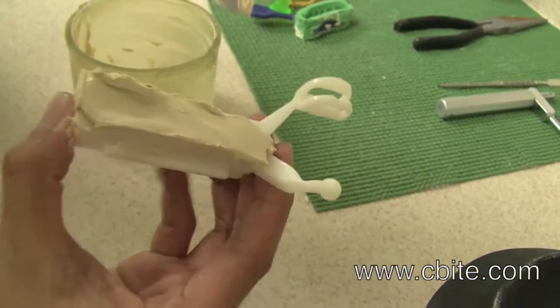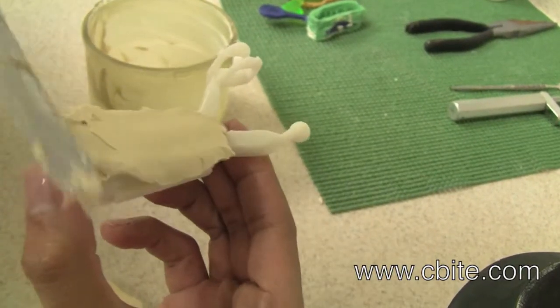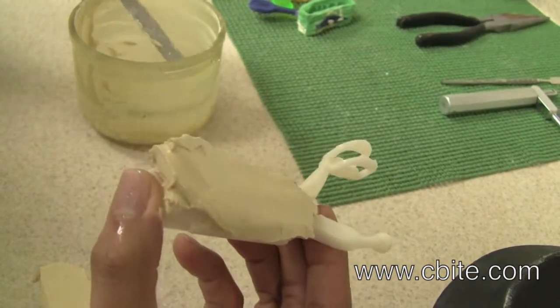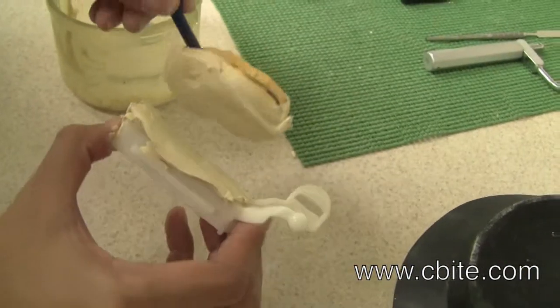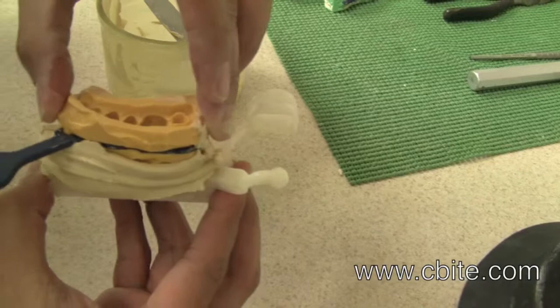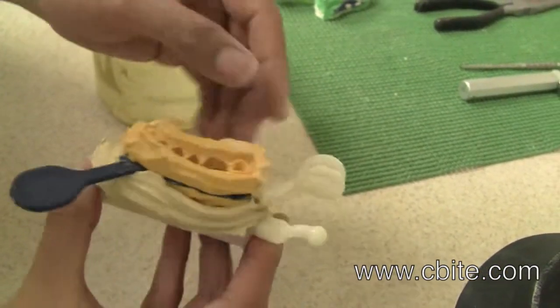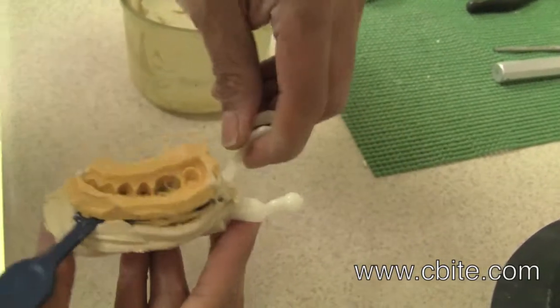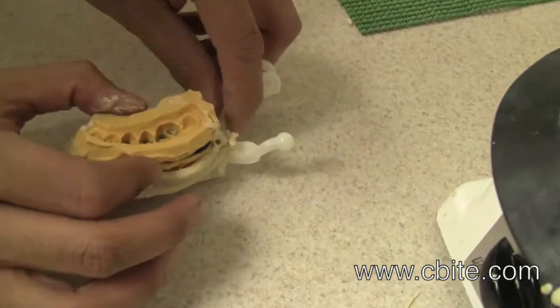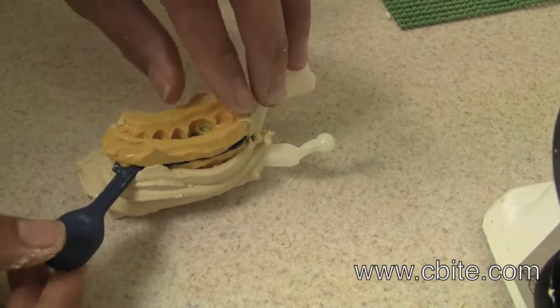Make sure you still have plenty of time to work with it, because if it starts to set too quickly, you will not have time to properly align it, shape it, and fill in any holes. You will not be able to have a properly mounted impression.